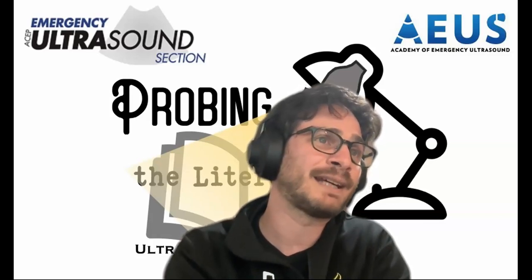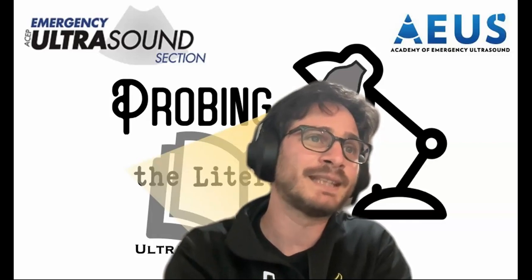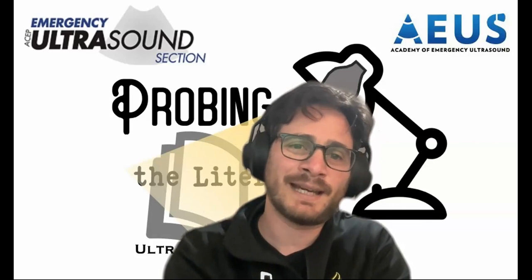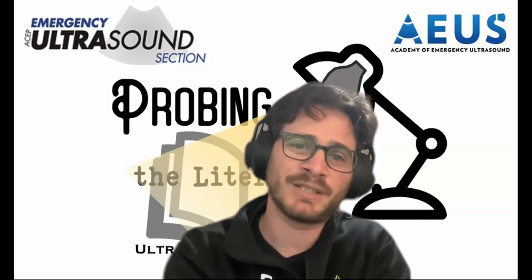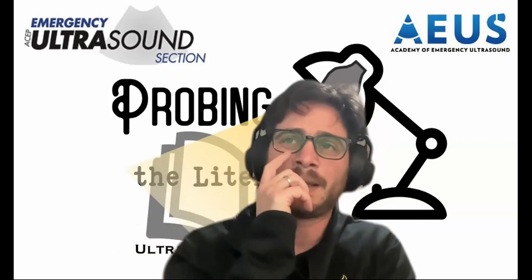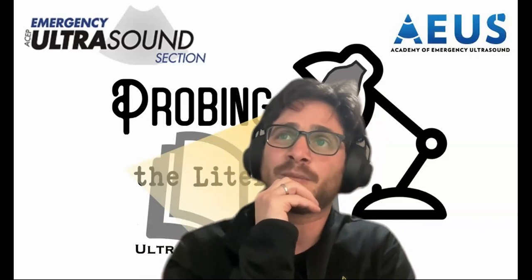On the flip side, if you're trying to find out does reduced EF need less fluid, you can't have the person doing the echo taking care of the patient and being aware of reduced EF, because that's completely going to guide how much fluid they're going to give, right? So all of those axes are going to be super important.